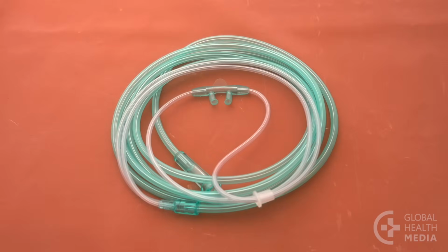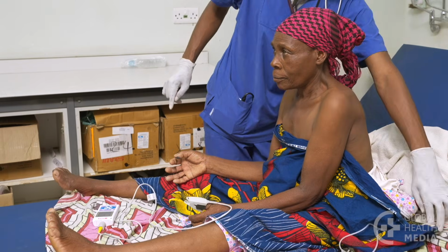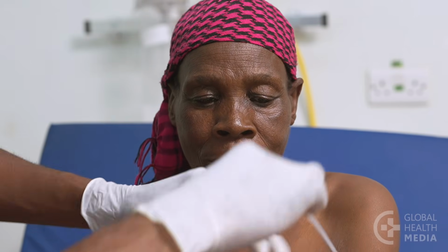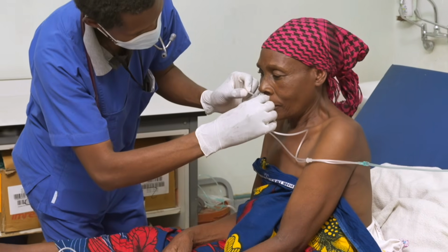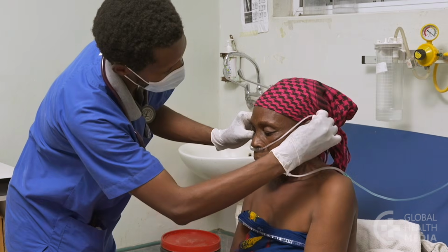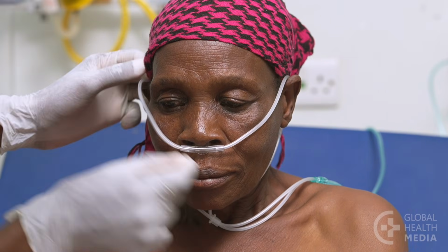The nasal cannula. If the signs of breathing difficulty are not severe, start by giving oxygen through a nasal cannula. Position the cannula in each nostril, then loop the tubing over the ears so that the tubing is on the front side of the patient's body.